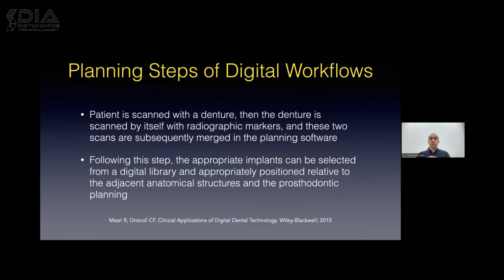Following this step, the appropriate implant can be selected from the digital library and appropriately positioned relative to the adjacent anatomic structures, and the prosthodontic planning starts from there.